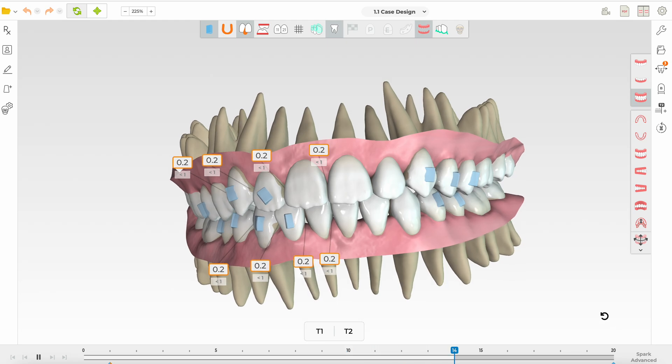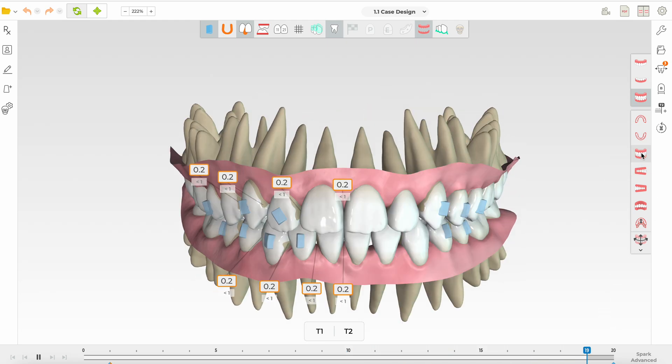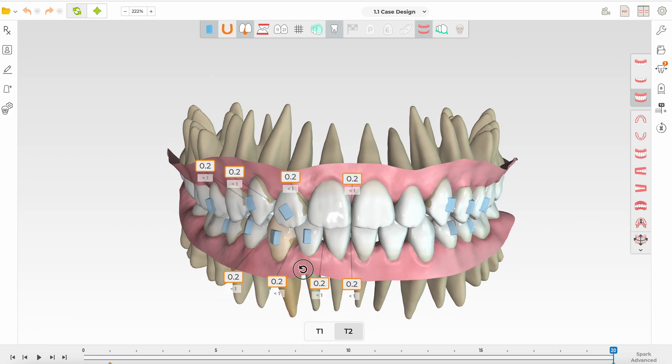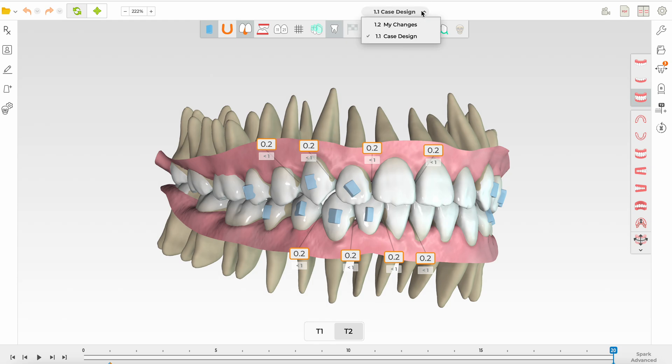There's asymmetric IPR that may make perfect sense because there is mostly crowding here. So it's asymmetric IPR, but I think the IPR is so small that I don't know how they even fit the teeth here.